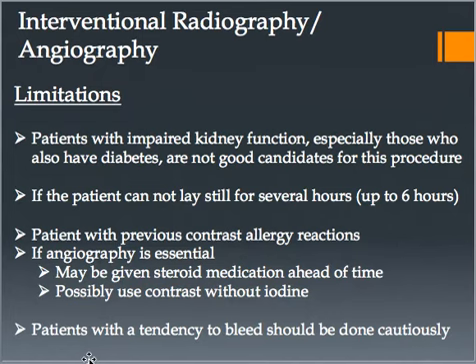So angiography isn't without limitations. I've said before that it's really great, but any patient that might have impaired kidney function, especially those patients that are diabetic, are not good candidates for this procedure. The iodine-based contrast that we use can actually cause kidney failure, and I did talk to you guys about that in CT and IVPs a little bit. So we don't want to give the contrast to a patient that has kidney disease.